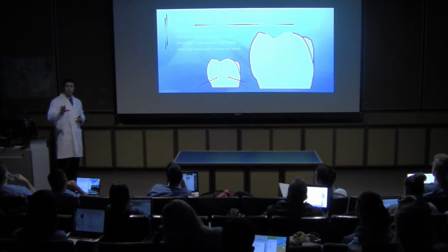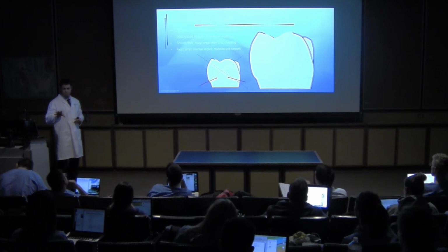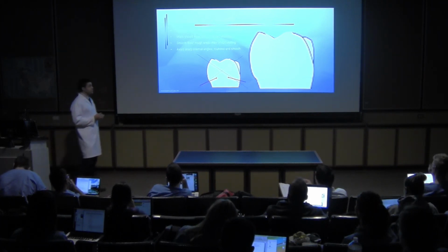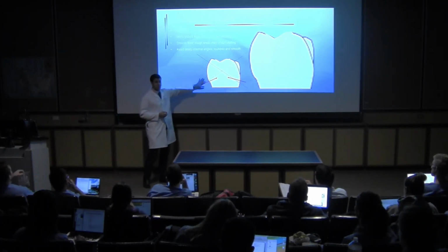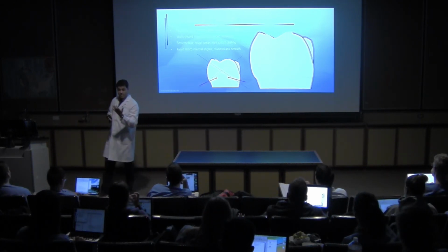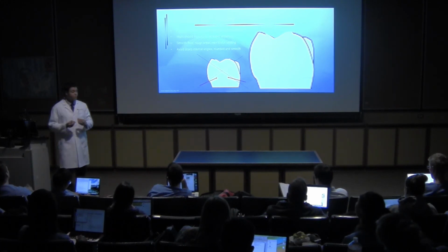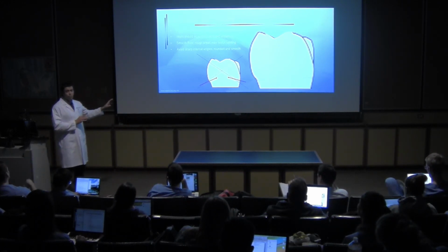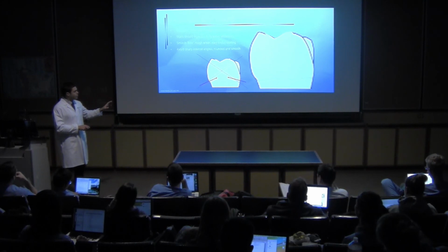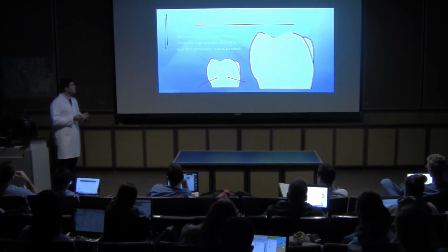If you are using the correct diamond point, you don't need to worry too much about this. It's important that you know the way it must be. But if you work with the correct diamond point, you will have the prep rounded.